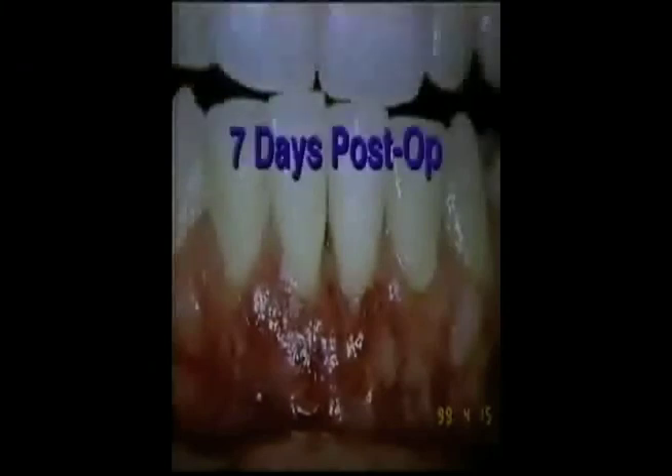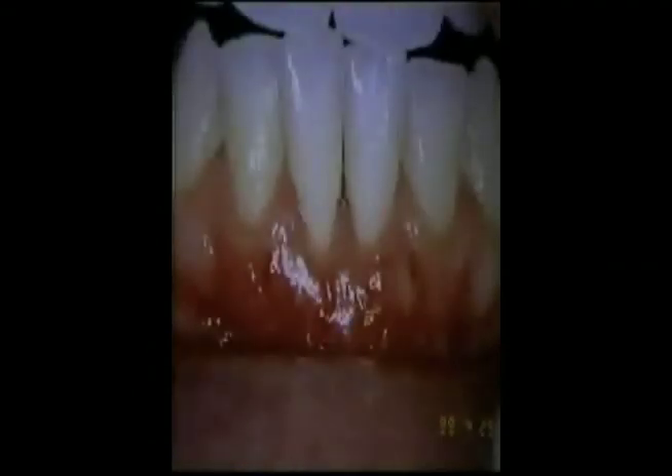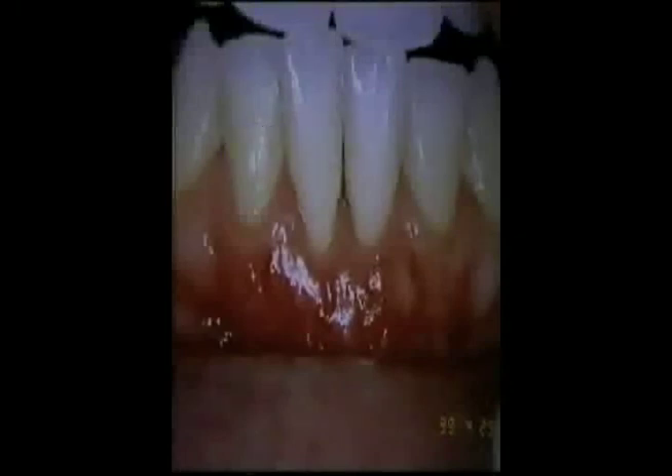The seven-day post-operative slide illustrates 100% root coverage of the denuded root surfaces, as well as an increase in attached gingiva. The 14-day post-operative slide also shows a slight increase in papilla height and form between teeth number 24 and 25.